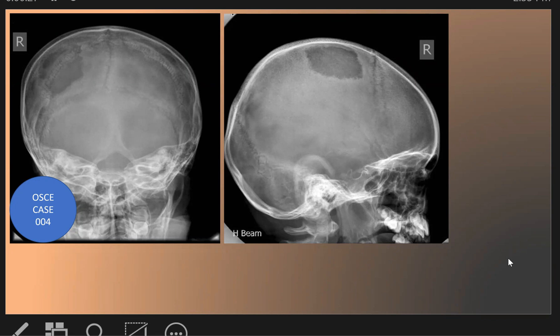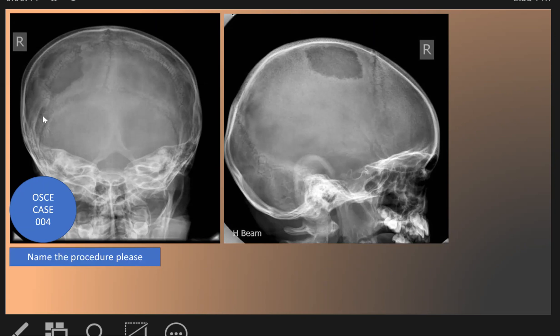This is a new OSCE case, number four. The first question: name the procedure. The procedure here is skull X-ray. The skull X-ray on the left side view is called Towne's view, and on the right side here it is the lateral skull view. So here we have Towne's view and lateral skull view. The Towne's view is an AP radiograph of the skull with angulation toward the feet.